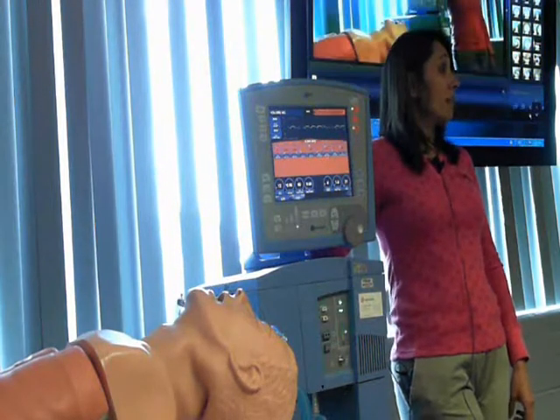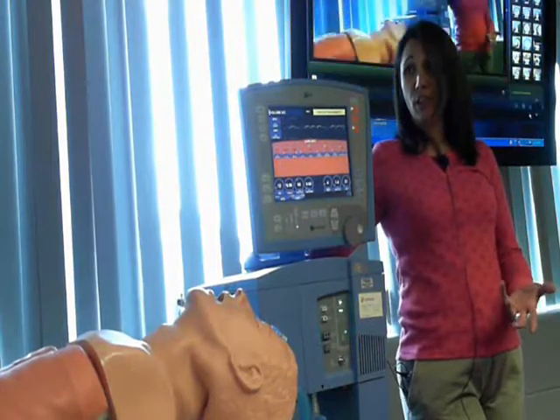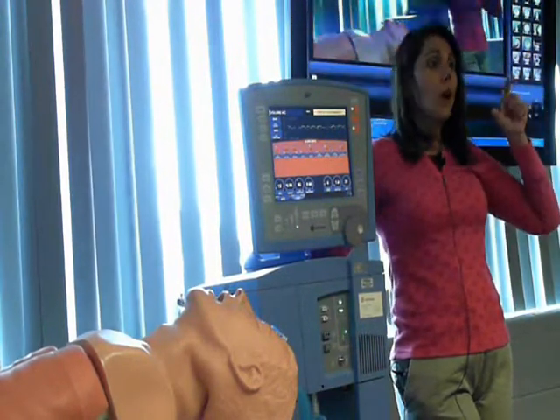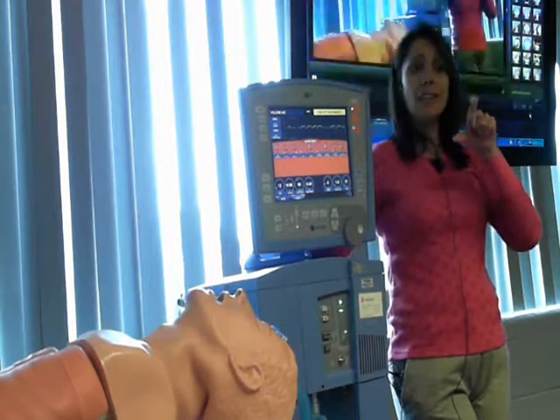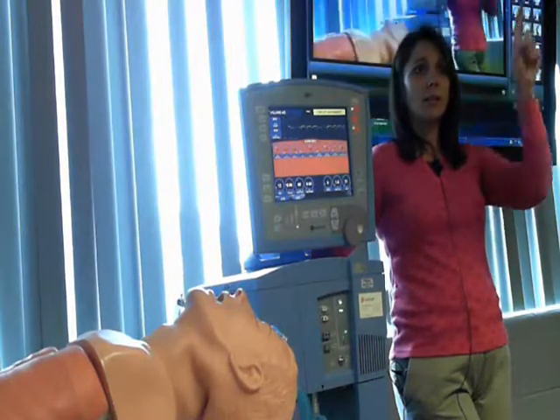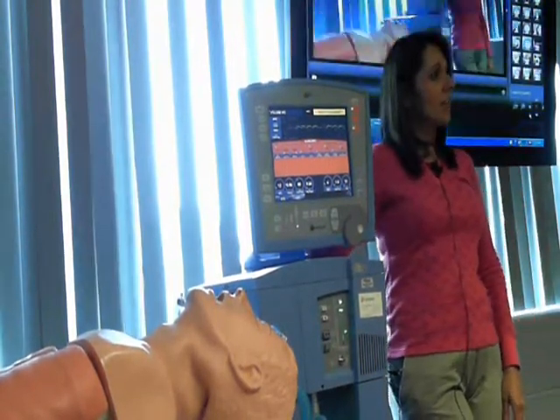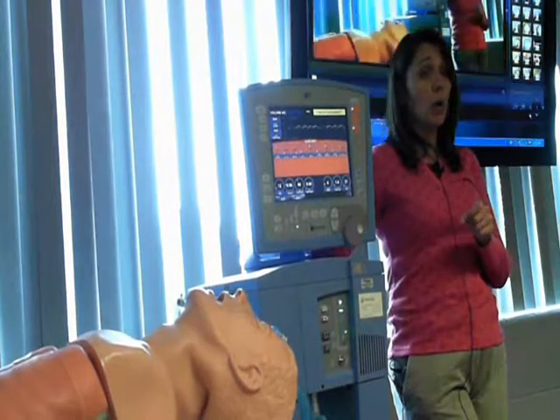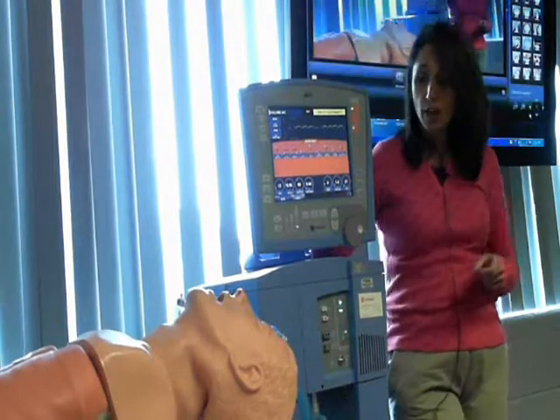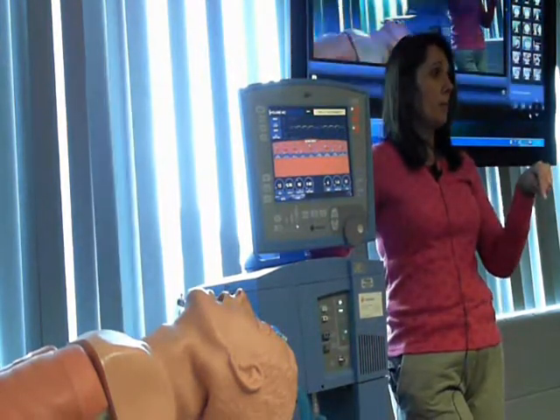Your breath sounds may not be abnormal. Most commonly, they're going to be maybe bronchovesicular or diminished. What I'm looking for, folks, is do your lungs get stiff or do your lungs get floppy? Somebody said it. Yeah. Stiff. Okay. When we ventilate stiff lungs, that's considered low compliance. When you ventilate stiff lungs or lungs with low compliance, you have to decrease your tidal volume.